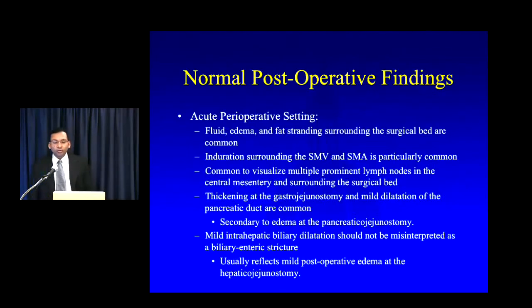Now, I think it's important, especially if you're not used to looking at a lot of these cases. In my case, I look at postoperative Whipples pretty much every day, right? We do hundreds of Whipple resections here at Hopkins every year, so I see postoperative Whipple procedures all the time. And over time, it becomes obvious what is normal postoperative change and what's actual pathology. But I work with residents and fellows who haven't seen a lot of these cases, and it can be very easy to mistake normal postoperative stuff from actual pathology.